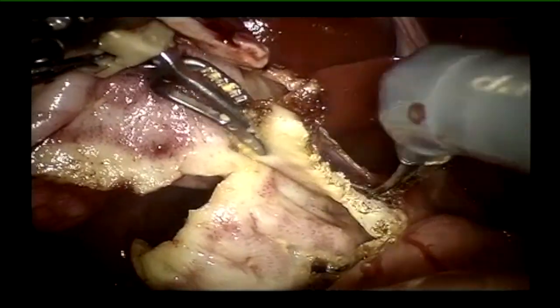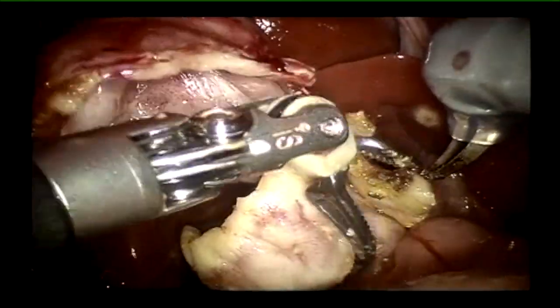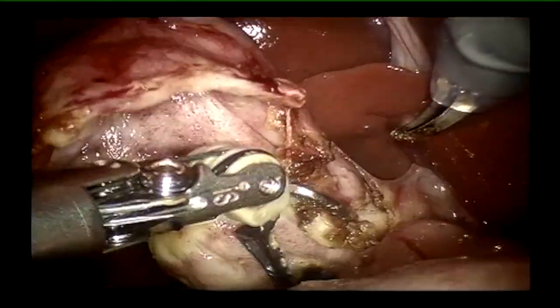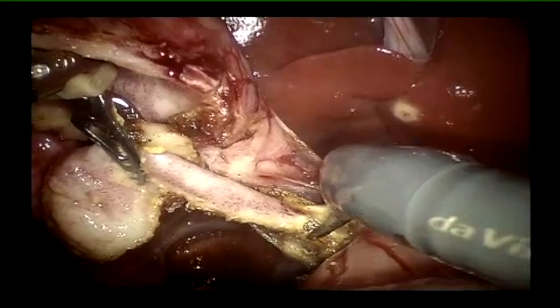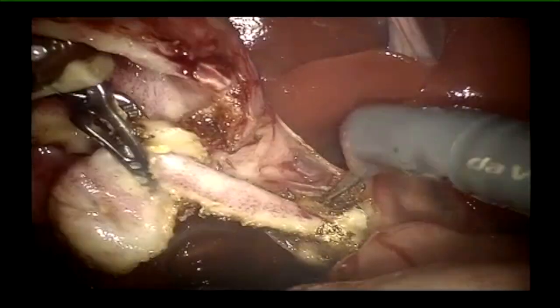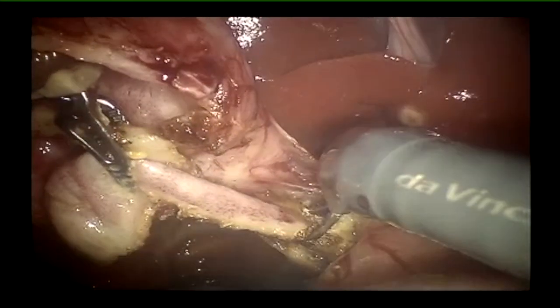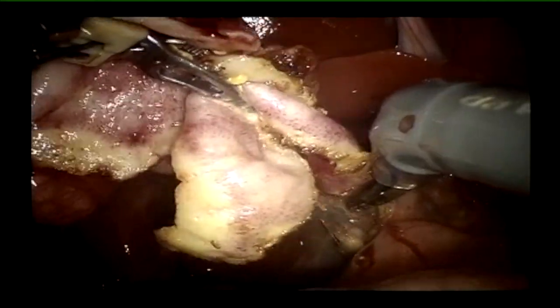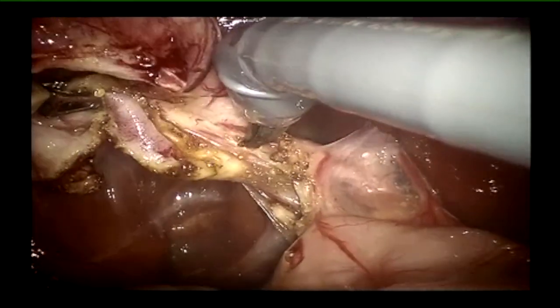My advice to budding robotic surgeons is to gain proficiency with standardized procedures first — like pyeloplasty — where the anatomy is well defined and the steps are clear. The challenge with choledochal cysts is that every cyst will have different anatomy, requiring a high level of proficiency. An ideal starting case would be a primary choledochal cyst without many cholangitic episodes, detected incidentally around five or six years of age.